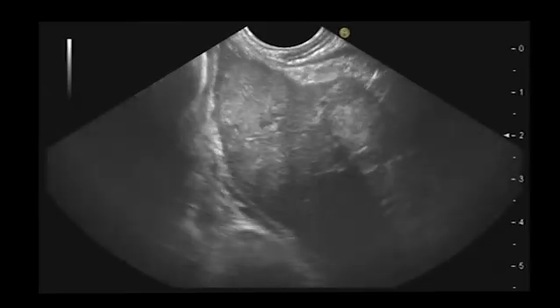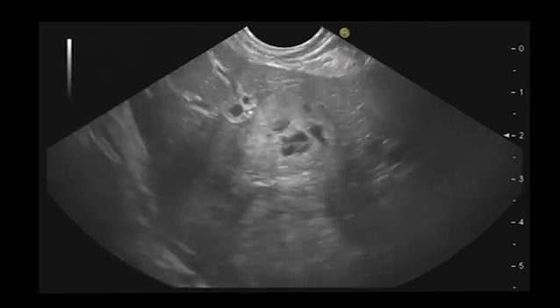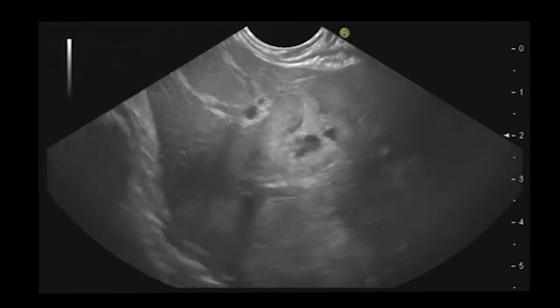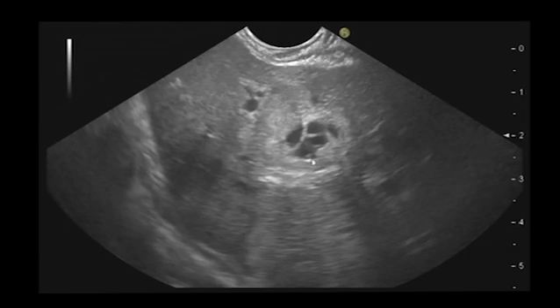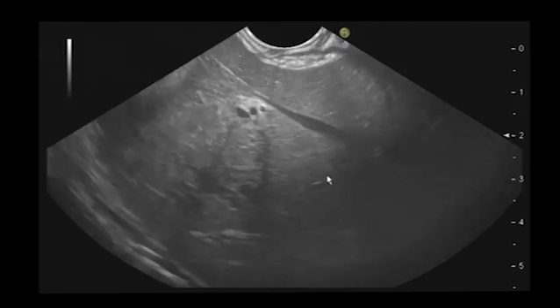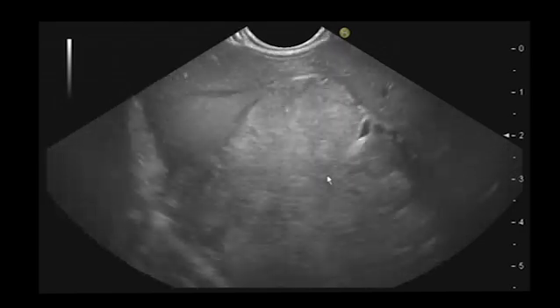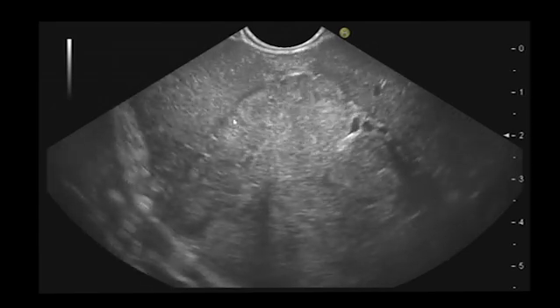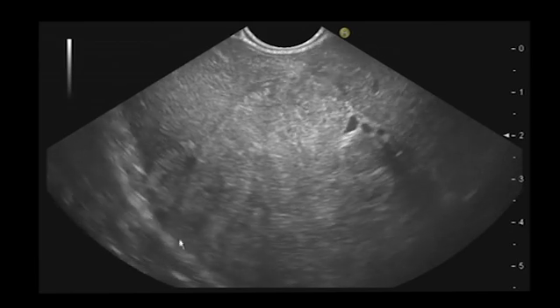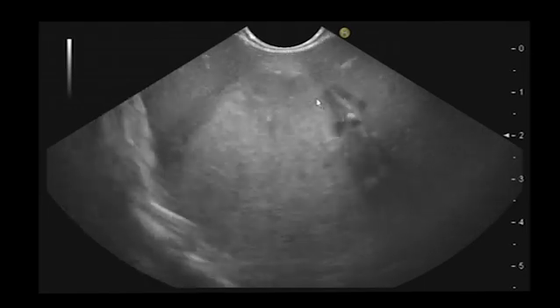Now I introduce the scope. I pass into the oesophagus, then into the stomach, and I will check, first of all, the liver. Here you see that we have a lot of metastatic lesions with necrotic areas. The aspect seems neuroendocrine because the mass is hyperechoic with a hypoechoic halo.